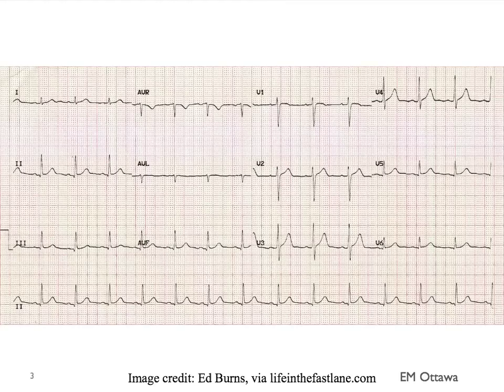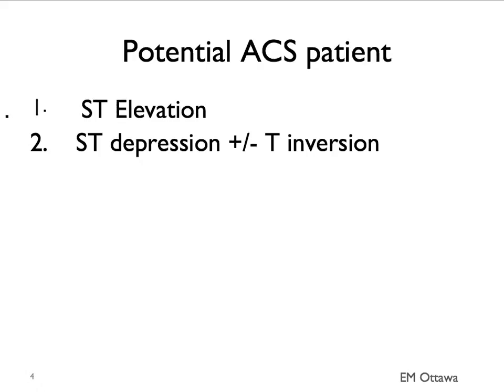This is a normal 12-lead ECG. When we're approaching a 12-lead ECG, we often start with rate, rhythm, axis, and so on. Once we make sure those are okay, we move on to more specific details. These specific details include ST elevation and ST depression with or without T-wave inversion.